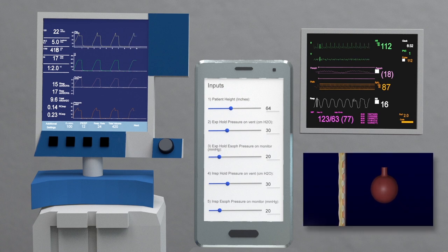Now let's determine the minimum PEEP necessary to keep transpulmonary pressure above zero at end expiration in order to overcome collapsing forces resulting in atelectasis.